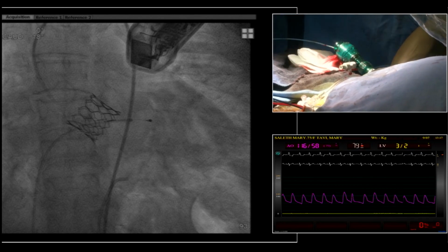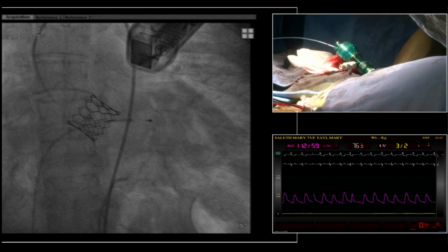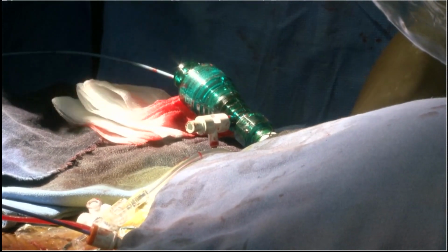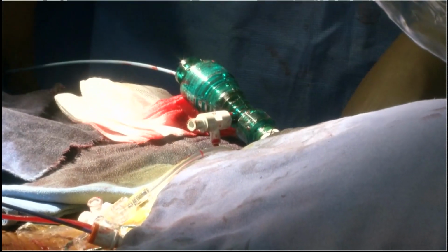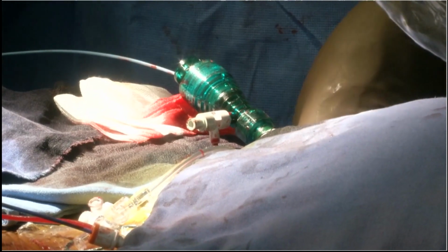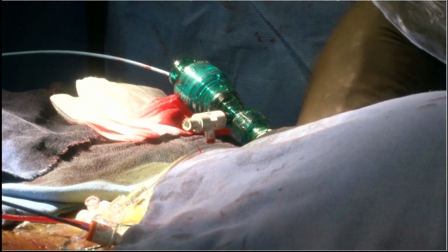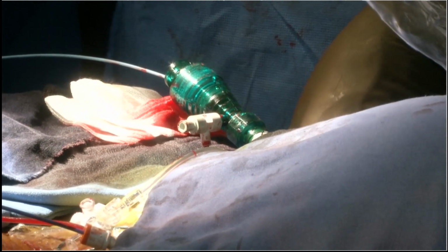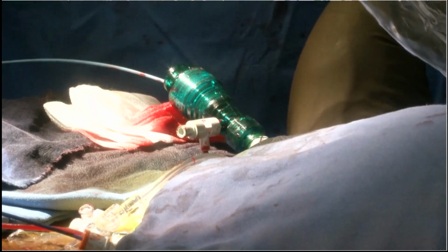What we generally do is make sure we have good monitoring when we remove the sheath. We put the dilator in, have the stiff wire, and when we remove the sheath, we have the practice of taking a wire crossover from the other side as we remove the sheath out. We deploy the ProGlide, and if we still have bleeding, we reverse generally 50% of protamine. What is your general policy? We don't reverse the heparin until we're happy with the closure. So we leave full heparinization and give protamine after the final angiogram. Yeah, exactly. But 50%, depending on the bleeding, we decide that actually.